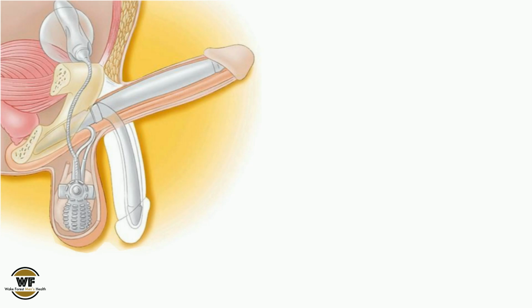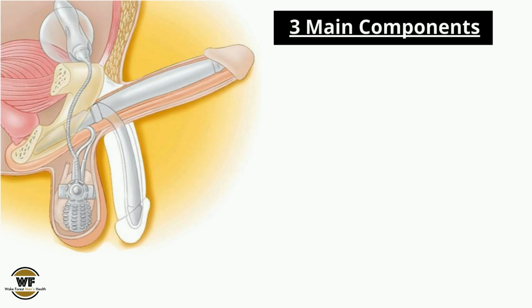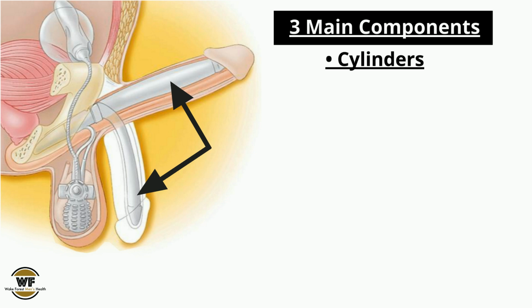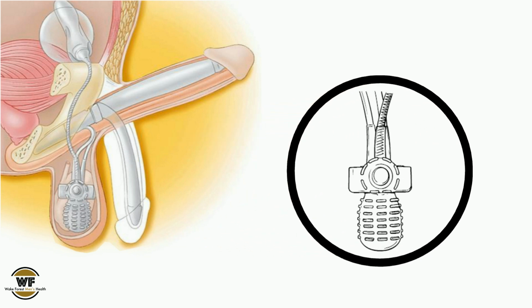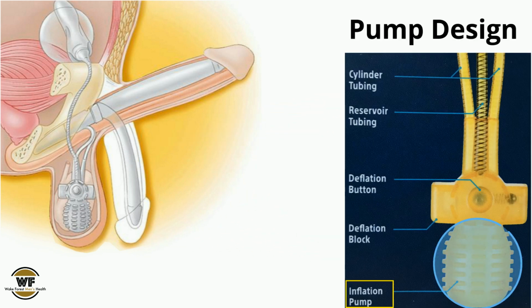Let's quickly review the design. The implant consists of 3 main components: the cylinders, the pump, and the reservoir. Today, we'll focus mainly on the pump. The inflation pump or bulb at the bottom is used to draw fluid from the reservoir and then send it out to the cylinders. The circular deflation button is located above the pump.